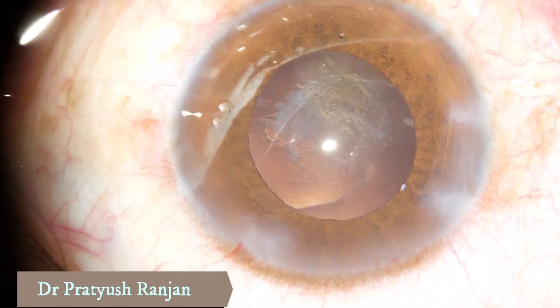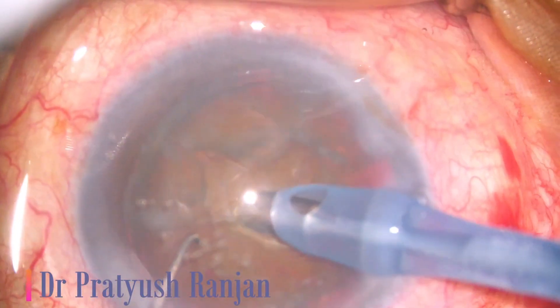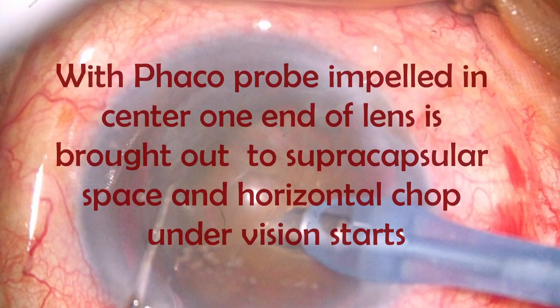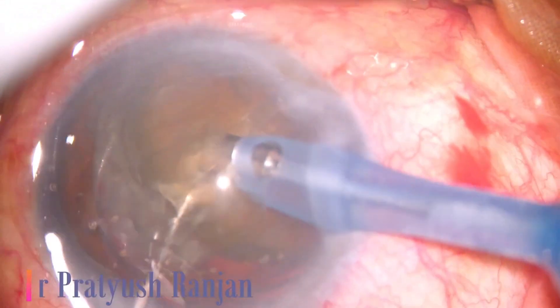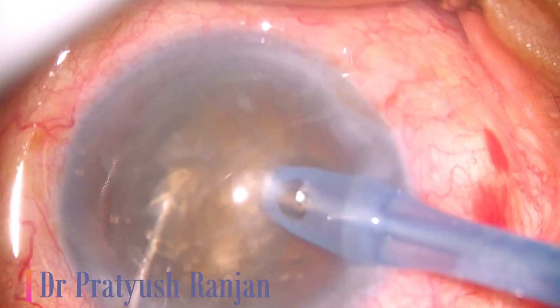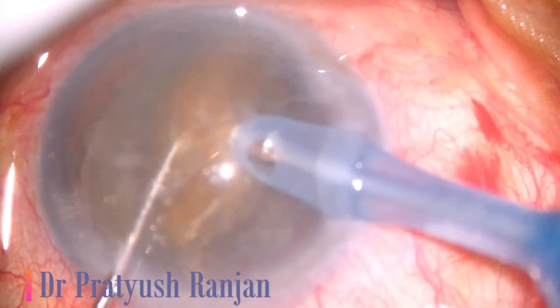So another technique — another video in which I have tried to explain this in a little slower version. The phacoprobe is impelled in the center and one end is pulled out horizontally, under vision. So it's not a blind procedure. Mostly I teach my fellows to start from stop and chop, and from stop and chop to direct chop. In between, you can use this cartwheel chop.